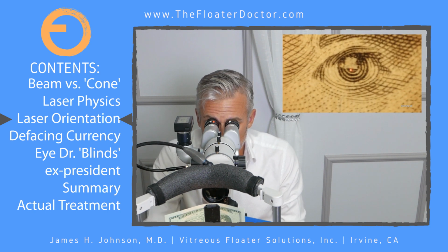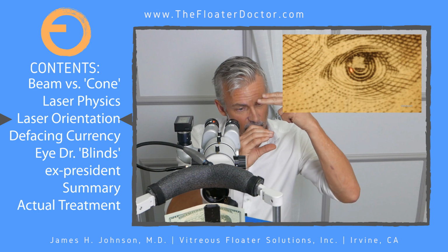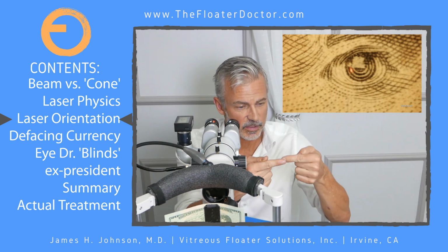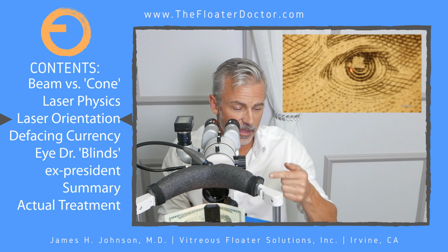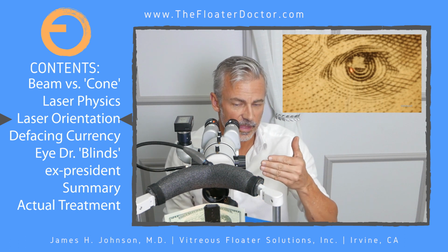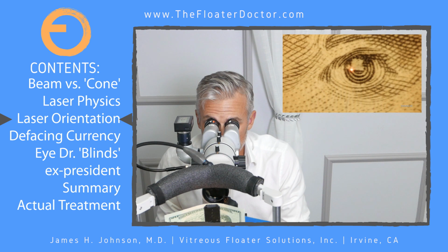And what you'll see are these two red focusing beams. That cone of energy along the top and along the bottom are these red focusing beams. And where those two beams come on top of each other, that's where the focus is. And you'll also notice as I jog the laser a little bit forward, a little bit back, those two red beams bounce around on top of each other, the focus goes in and out of focus very quickly. It's a very, very narrow focal plane here.